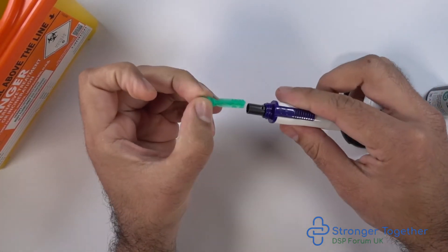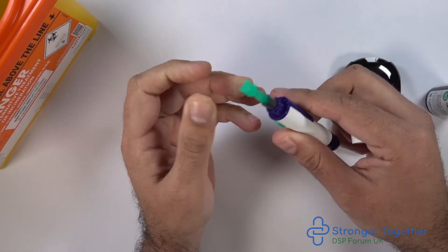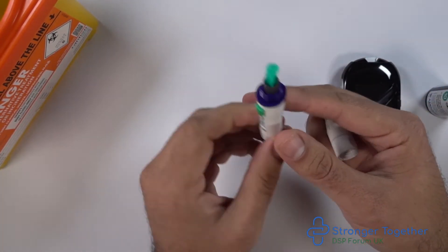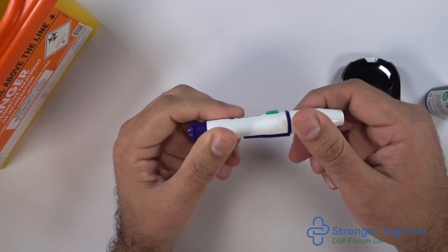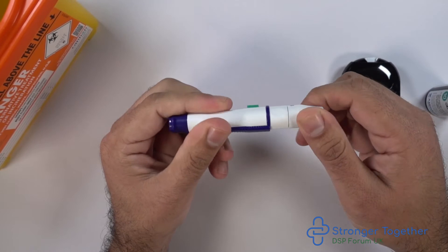Unscrew the end in an anti-clockwise direction and then push the lancet in as far as it can go. We then twist off the protective end of the lancet, which exposes the needle within. Now screw the end of the lancing device back on in a clockwise fashion, ensuring that it's hand tight — otherwise the top will come off, just as you can see here.